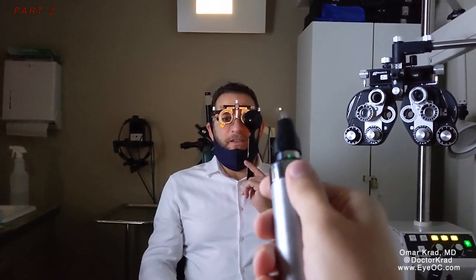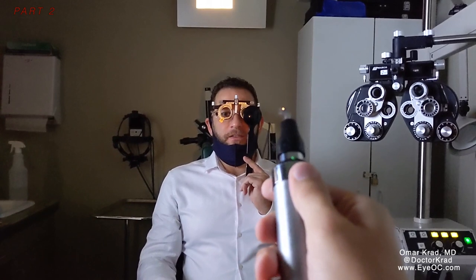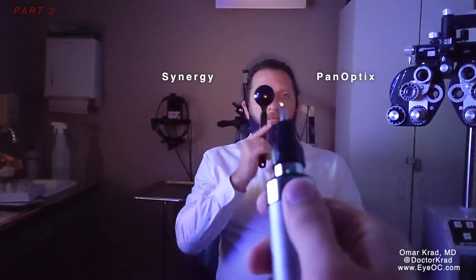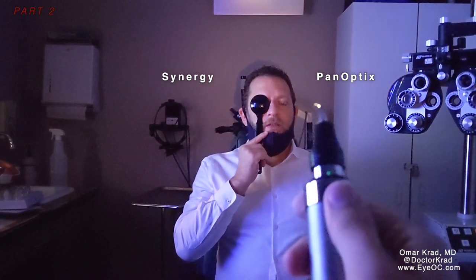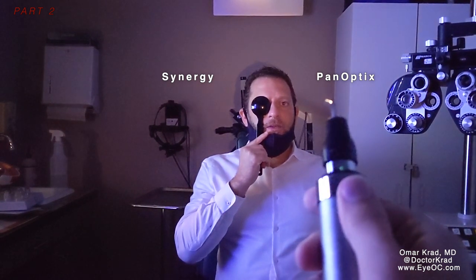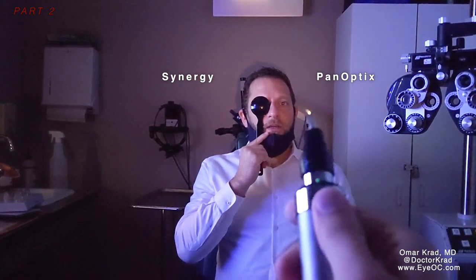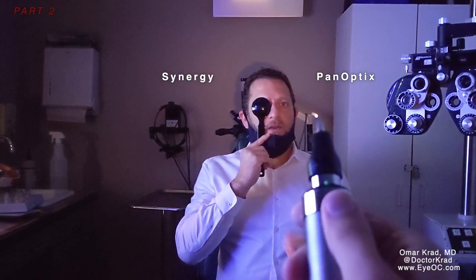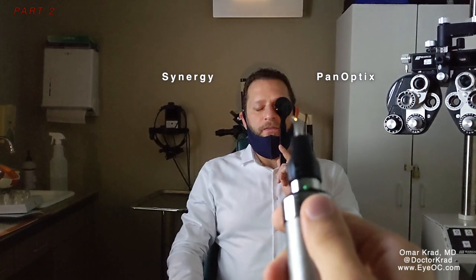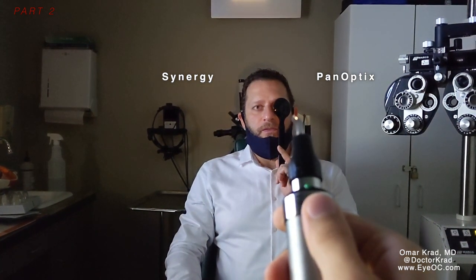Let's see if the lenses you're wearing have anything to do with it. Take those off and put them on the table. So those reflections are gone now — things from the left are gone, and it's better on the left. The halos and starbursts — this one is definitely more pronounced, more starbursts.